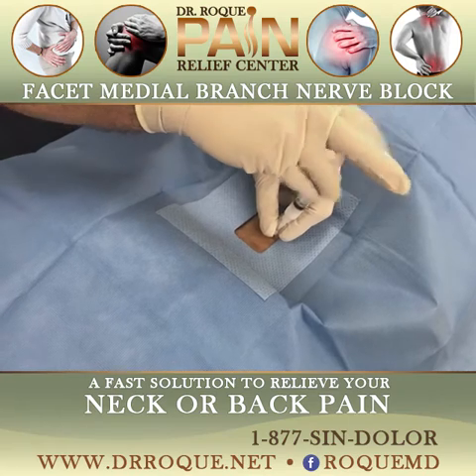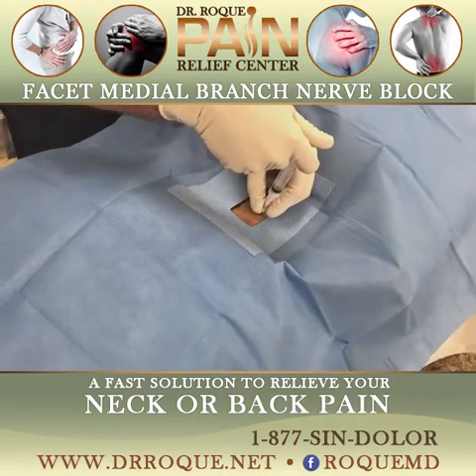Here we go. Pressure, pressure, pressure. Is that the pain? Mm-hmm.